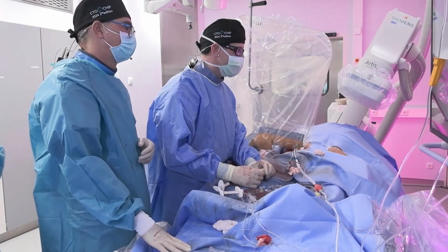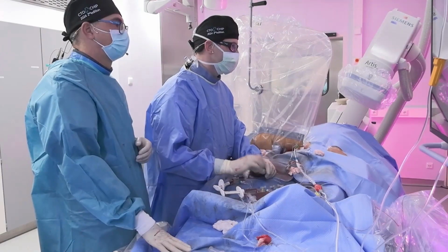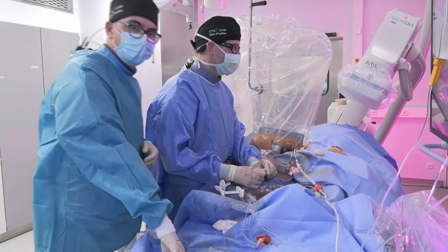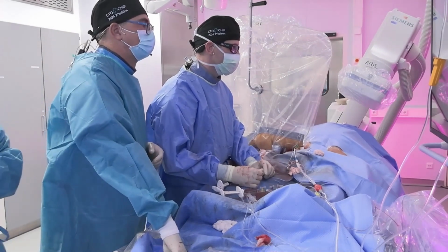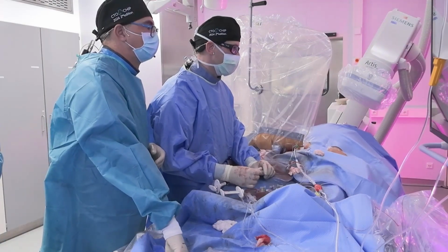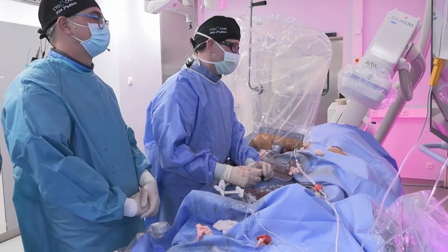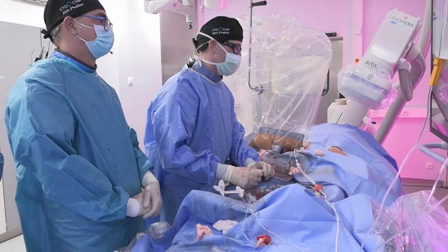These are very difficult cases when you have to go retrograde through here. What would you think about getting a zoomed-in image, possibly a high frame rate zoomed-in image, using also high pulses to really see how the stent looks as you're going in, especially if you're going to go with a Gaia? Yeah, that's definitely a good idea. I mean, we have used some radiation already, about the 12,000 right now. Yeah, that's definitely going to be a good option once we have to go for a steerable wire.